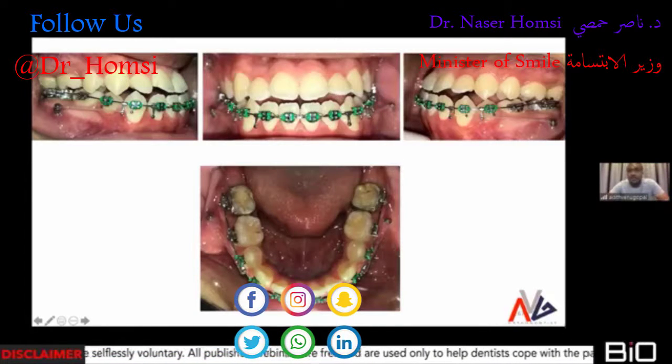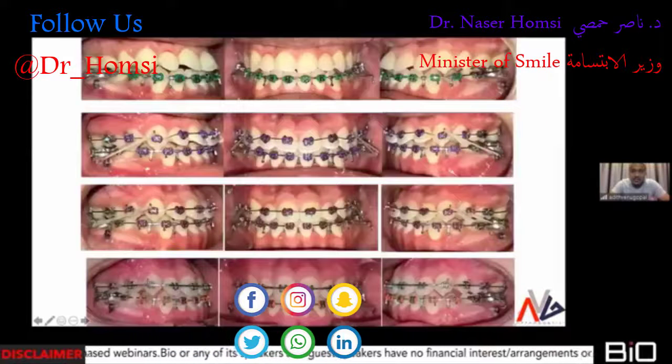My objectives were to get the lowers in and auto-rotate the mandible, because such mechanics, whenever you use buccal shelf, by the way, the posteriors go down and the anteriors go up and induce a counterclockwise rotation on the mandibular occlusal plane, which is good for the open bite. And as you can see, exactly that's what happened. By the end of distalization, you can see that I was able to generate a counterclockwise rotation of the mandible, which helped me close the open bite.